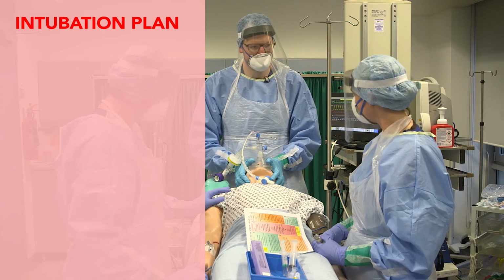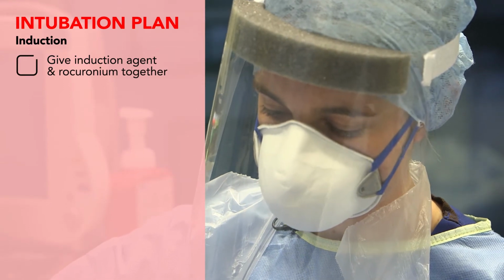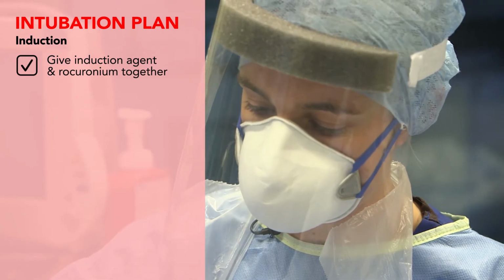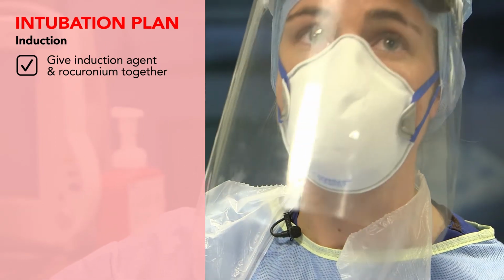Okay, if everyone's happy, we're happy to give the induction agent. Yep, so induction agent going in. I'm going to give 100 milligrams of rocuronium. And I'm just going to flush that in now and we'll start timing for a minute now.